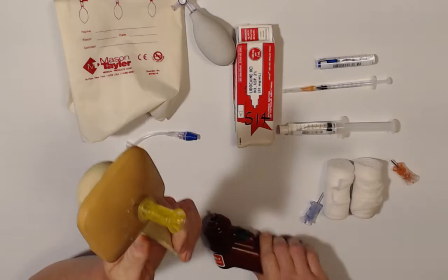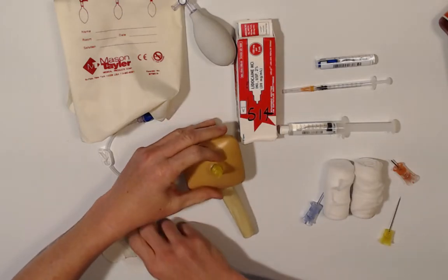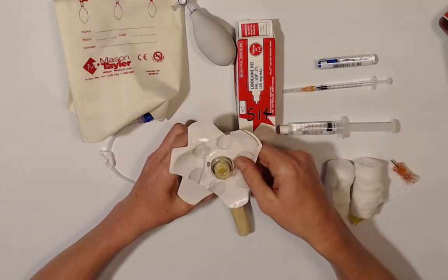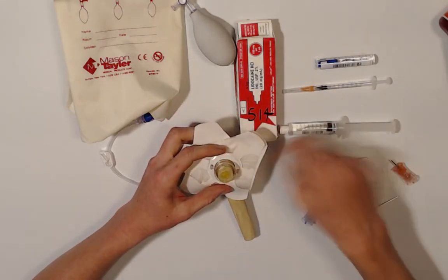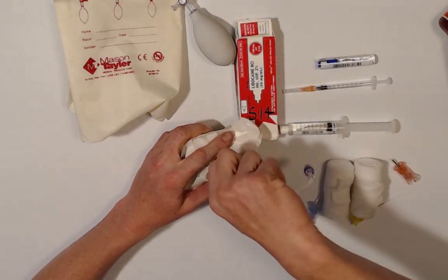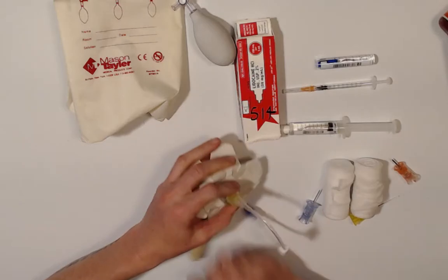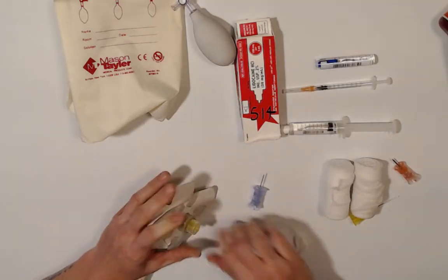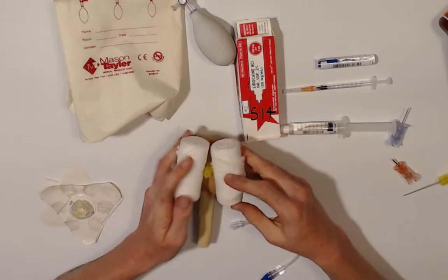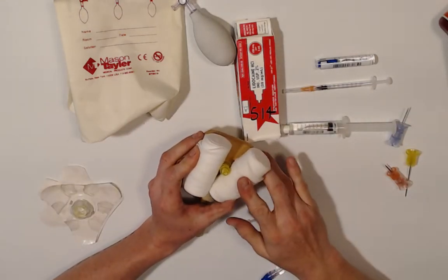Now, if you're doing a shoulder IO, I highly recommend that if you have this device, this is what we're going to use. This device would have to go over the IO first. You peel that wax paper off, stick it, and then we would put our tubing right on top of that. That's going to help anchor everything together. If you don't have this device, then you're going to have to use 2 rolls of cling, kind of sandwich it here, and being on a shoulder, you're going to be throwing duct tape probably in every possible direction to really hold that in place.